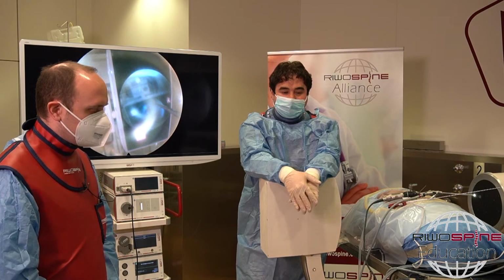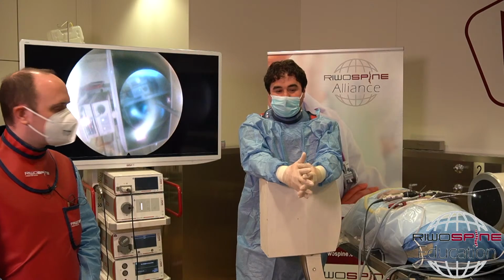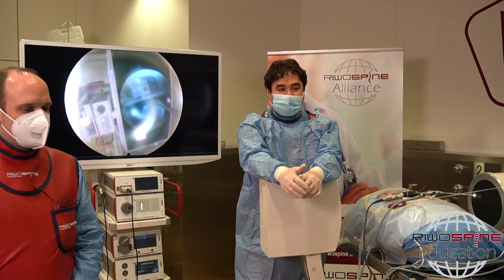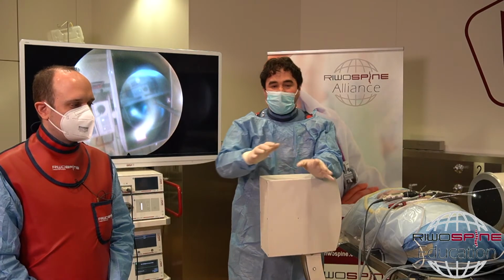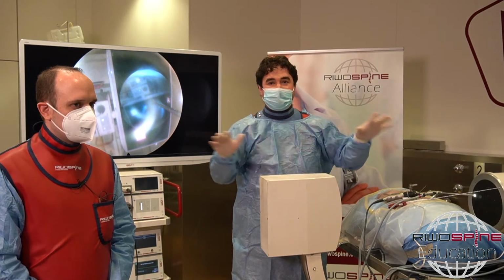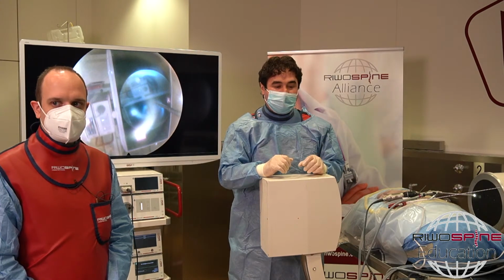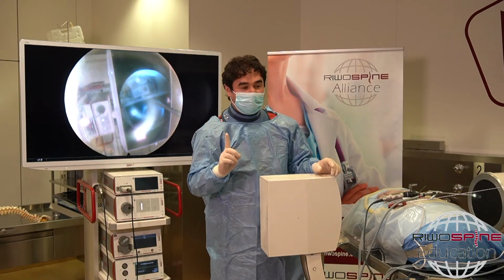You're right. Also, the most difficult part, in my opinion, for beginners in the interlaminar approach, is to open the ligamentum flavum. There are some tricks here. Of course, we focus more on the hands-on trainings. First of all, you have to have a clear picture of the ligament. Dissect all the soft tissues around it, and then you can see the ligamentum flavum clearly.